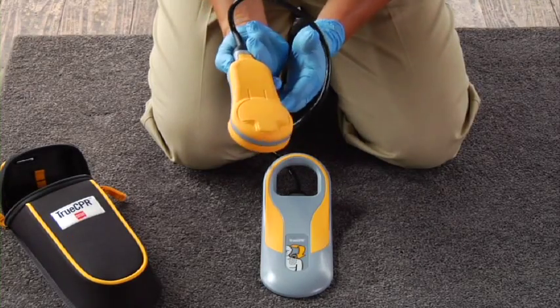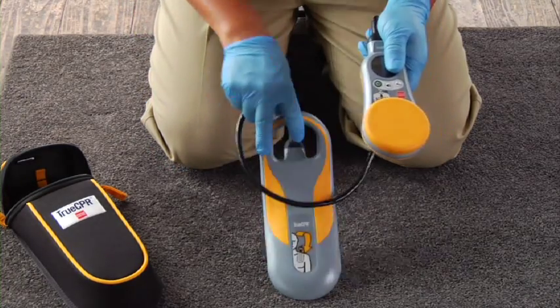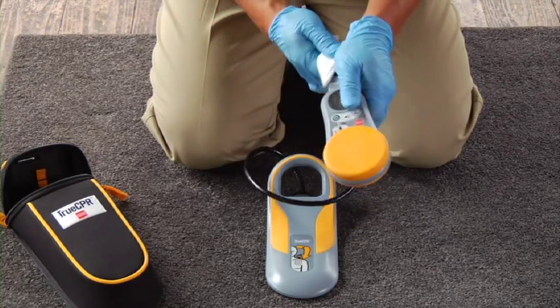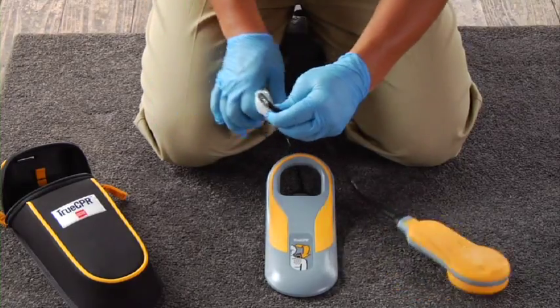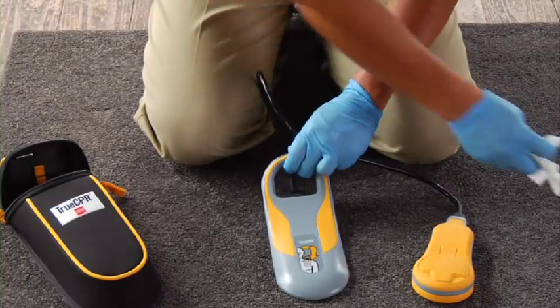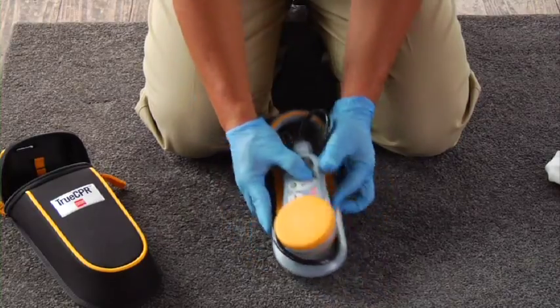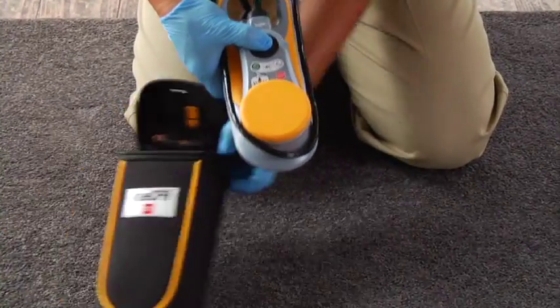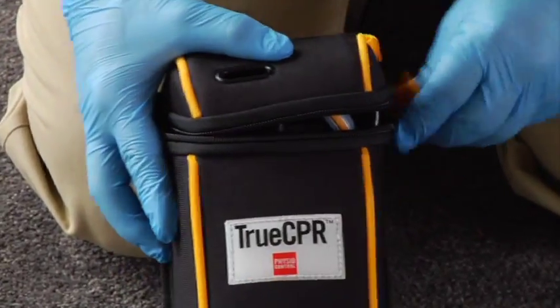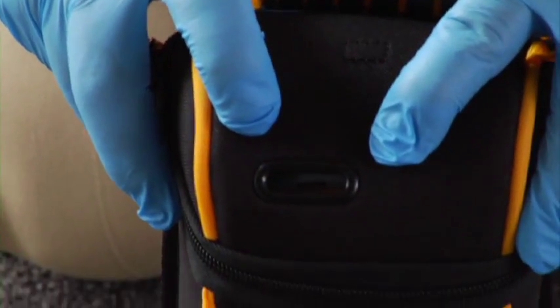After you use TrueCPR, inspect the device and cable for damage and wipe them clean. A list of recommended cleaners can be found in the instructions for use — don't immerse or soak the chest or back pads. Place it back in the bag and be sure the flashing green battery indicator light is visible; it flashes green about every four seconds.